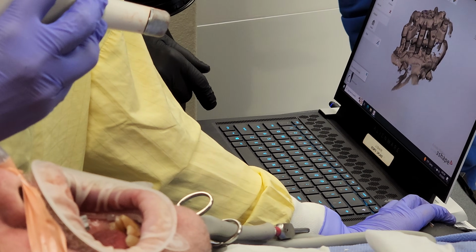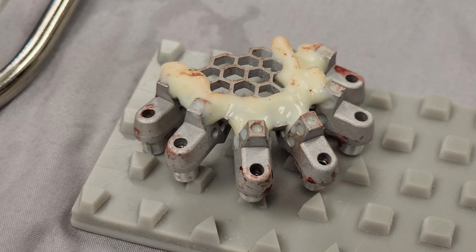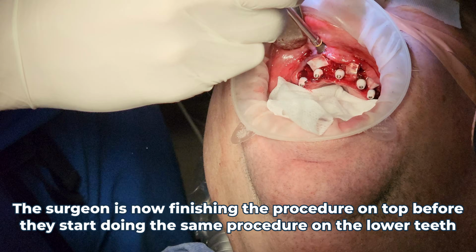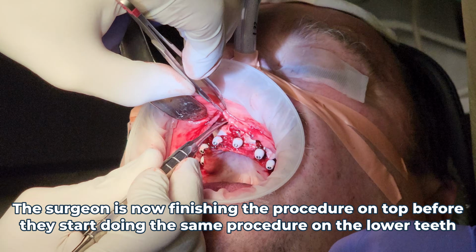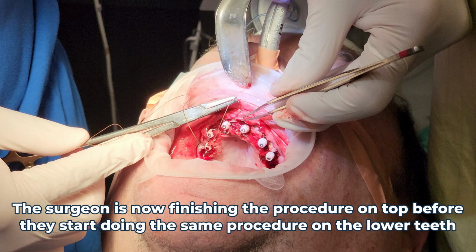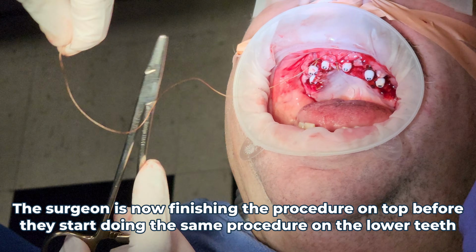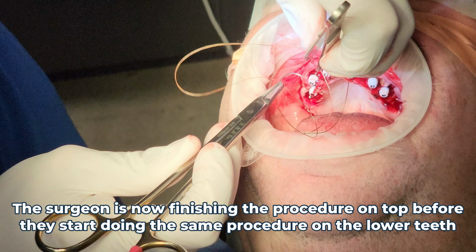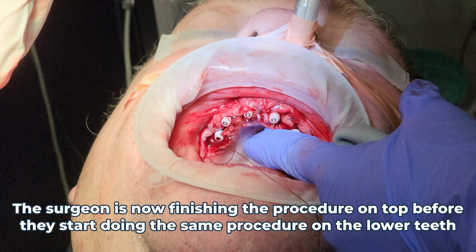And so once we have arrived at this point, we have 2 simultaneous treatments going on at the same time for the rest of this appointment. One pathway of treatments will be done by the surgeon, and one pathway will be done by the lab technician or the dentist. What the surgeon is doing is finishing the procedure on top and then starting the exact same process on the lower teeth. So once he finishes on the top, he puts on the white caps and a resorbable membrane over the bone grafts and sutures everything back up. And then he'll move on to the lower teeth.